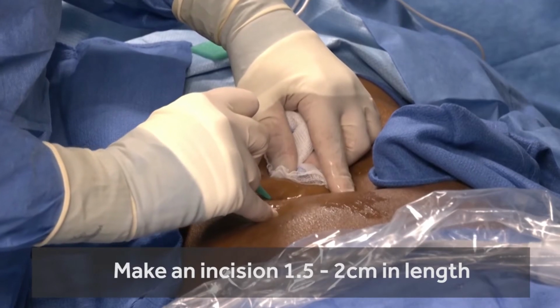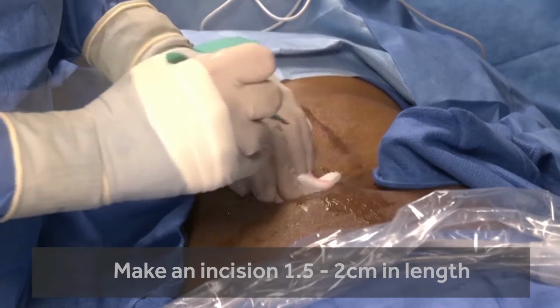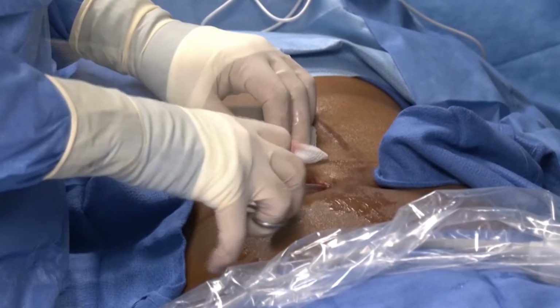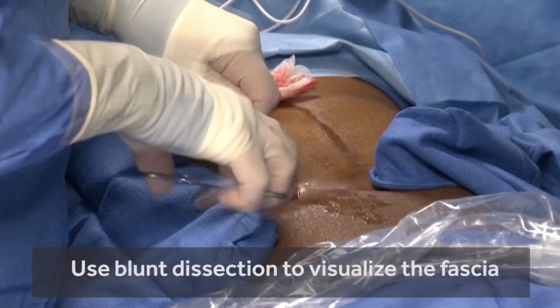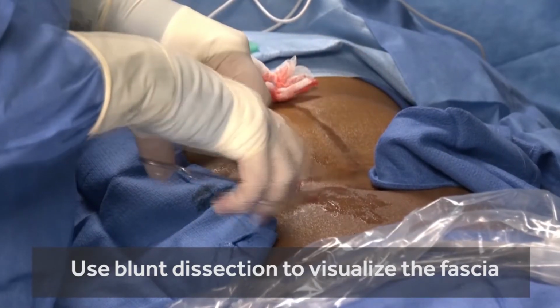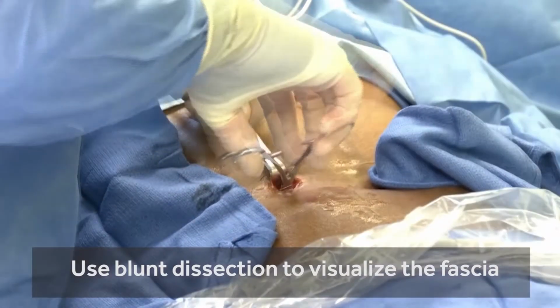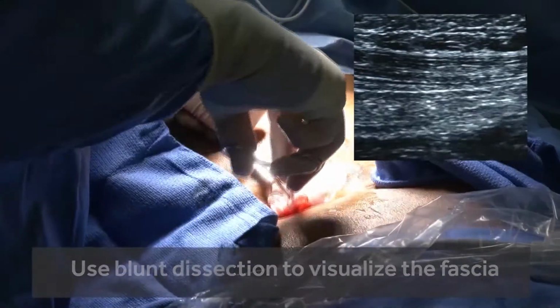And in our incision, we do not want to get involved with the inferior epigastric artery, which runs along the rectus sheath. And now we're going to use blunt dissection because we want to get down to the fascia. I prefer to puncture the peritoneum through the open incision because trying to make this incision around a 21 gauge needle is just too cumbersome.